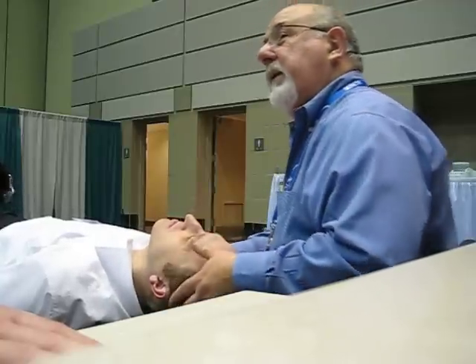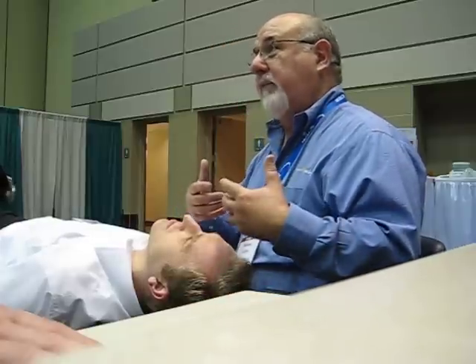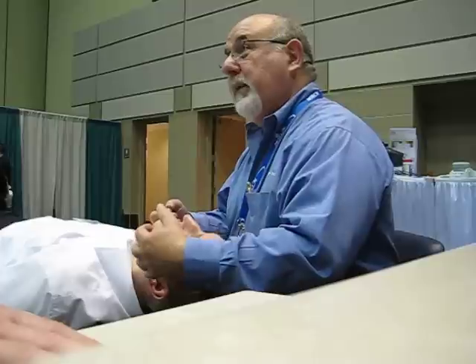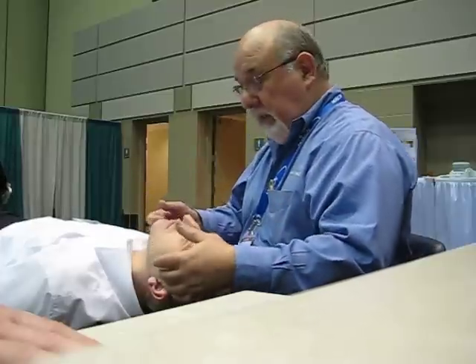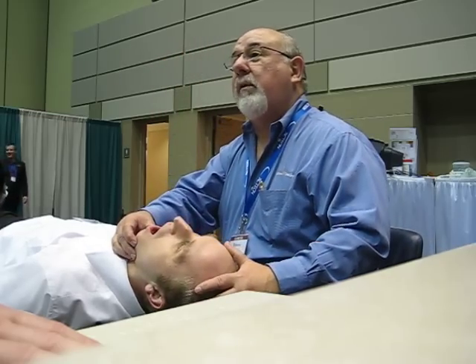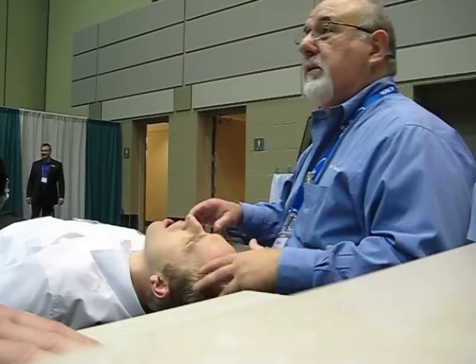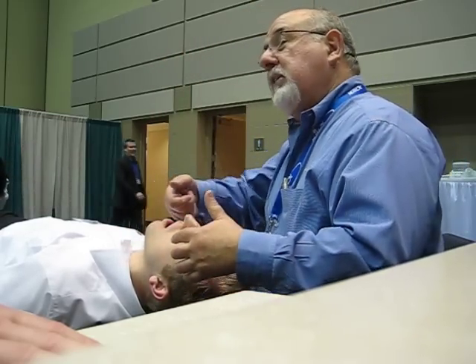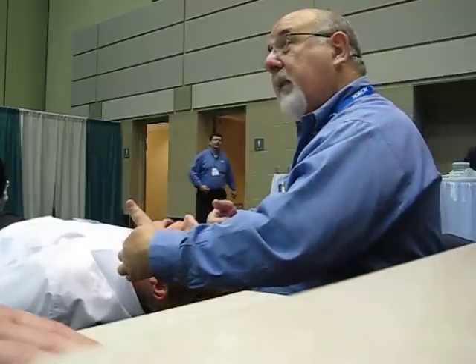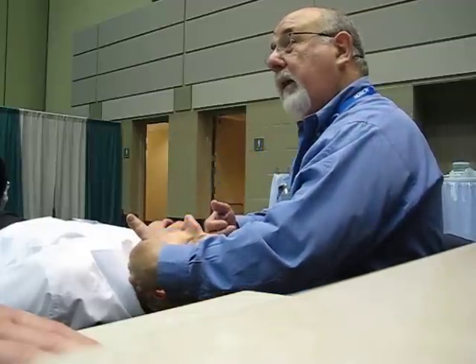So what does that mean? It means I don't have to stand on my head, and you don't have to stand on your head for us to be able to work in any area of the mouth. The other thing that happens is, see how the tongue has sealed off the throat? That's because we're in this position. That means that I could actually spray across the back of the palate, and you could lock on a buckle over here to evacuate. I could be working out here and you'll create a vortex, a whirlpool of air, and actually the water will wash across the back.